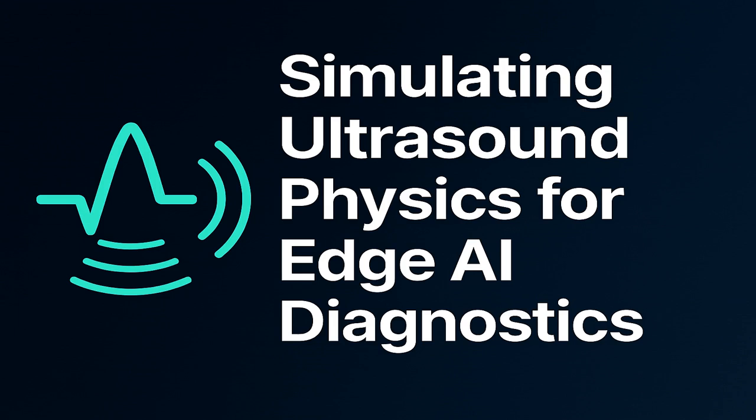It's a serious artifact. We use Doppler in two primary modes. First, there's the real-time, more qualitative approach, color Doppler. Color Doppler is all about spatial mapping and speed. It uses an algorithm called the autocorrelation method, specifically the lag-1 correlation, to rapidly estimate the mean Doppler frequency within each pixel. And then that mean frequency is converted to a velocity and mapped to a color scale, which gets overlaid on the B-mode image. Yep. Conventionally, it's red for flow towards the probe and blue for flow away.